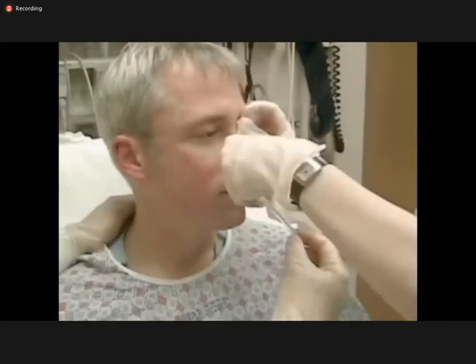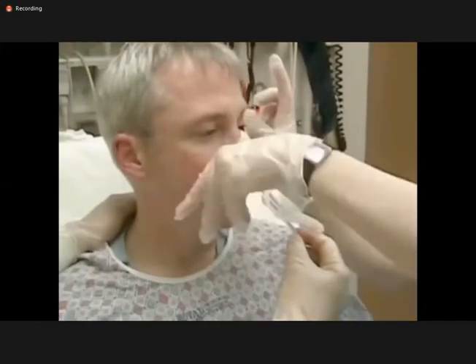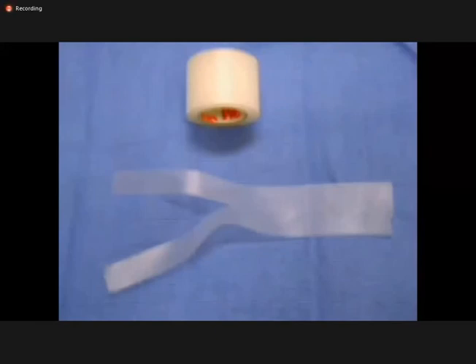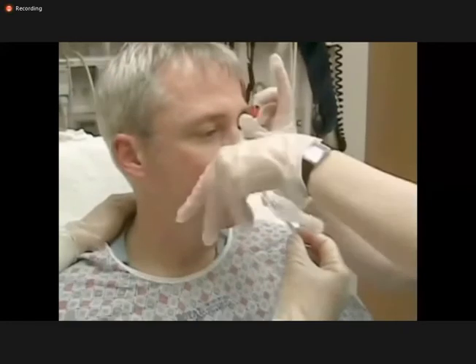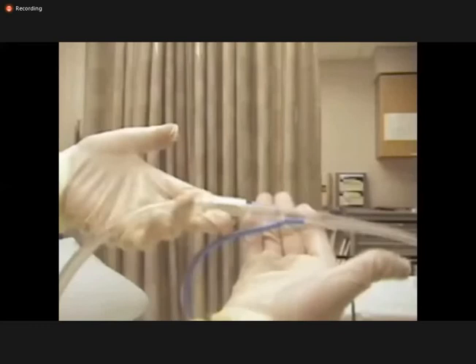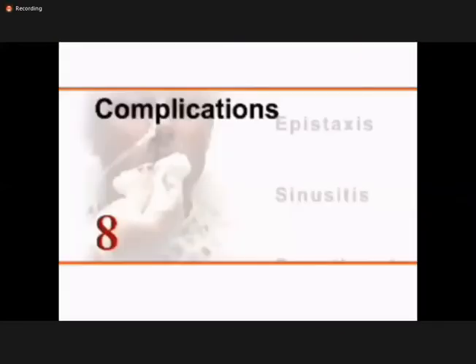The tube should be secured to the patient prior to transport to the radiology suite. At the end of the insertion of the tube, how to secure? Take adhesive tape and cut into a Y shape. Take a 5 to 7 centimeter strip of adhesive tape and tear it vertically for 1/2 of its length. The wide section is placed across the patient's nose, and the two tails are then wrapped in opposite directions around the NG tube. You may now connect the nasogastric tube to suction. Turn on the suction and adjust the vacuum force as desired.